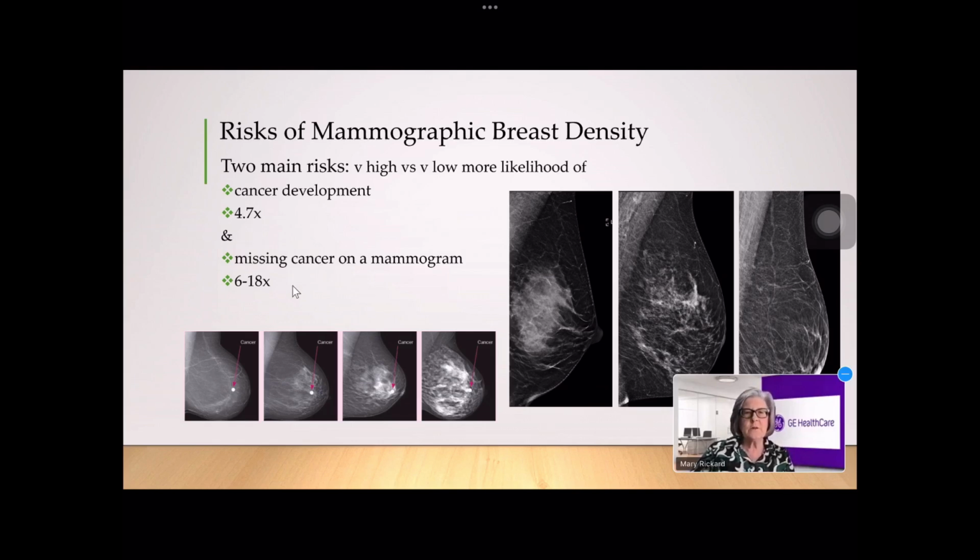So you could see from these 3 cases that this ill-defined density, non-specific density, which is in fact a cancer, is relatively easy to see in this breast. It doesn't have very specific features, but just because it's there, in an empty area, it's pretty easy to see. If we go to this moderately dense breast, we can see that in fact we can find cancers in these breasts without too much trouble if they're in the right place.